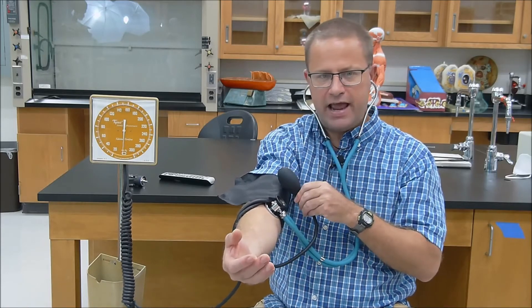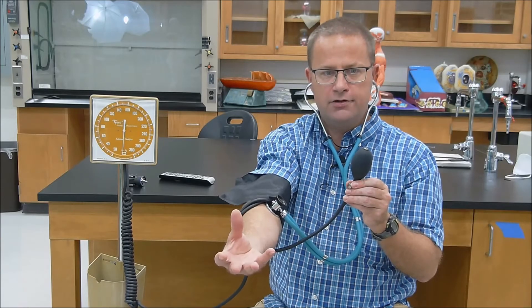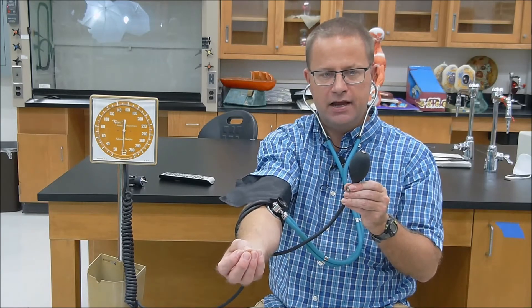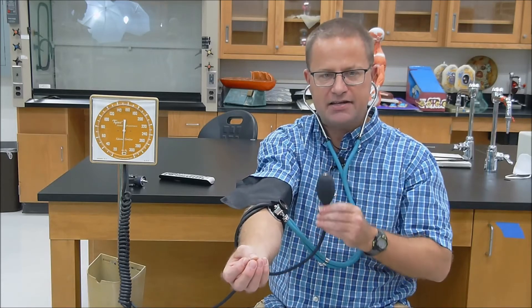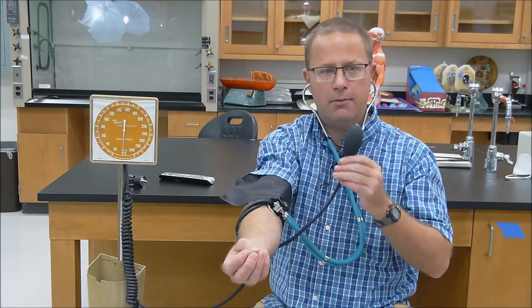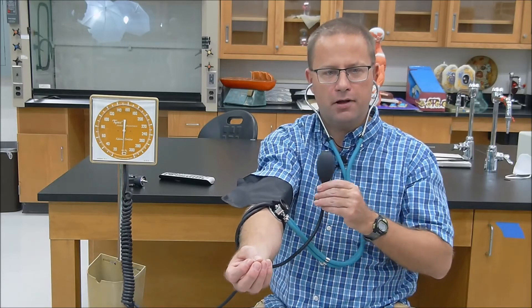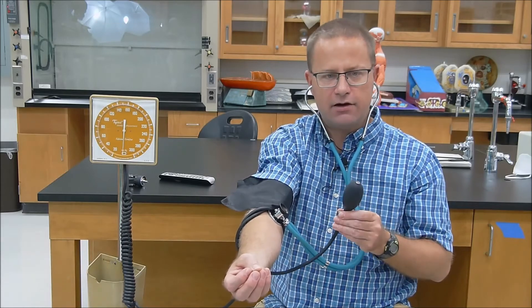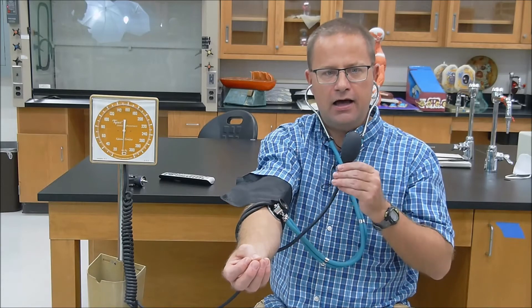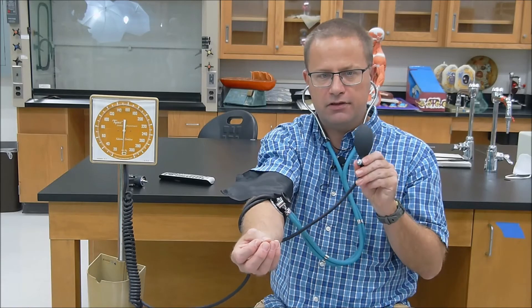What you're doing essentially is putting air in here until it creates a tourniquet and is cutting off all the blood flow to the distal extremity. As I let off that pressure, eventually some blood is going to eek past there, and those are the sounds of Korotkoff. Basically it's letting us know that we're now below the systolic pressure. The pressure at which I first hear a heartbeat or a pulse rushing past the stethoscope is the systolic pressure. I keep letting that off, and eventually there's a pressure at which I no longer hear anything, and that's the diastolic pressure.